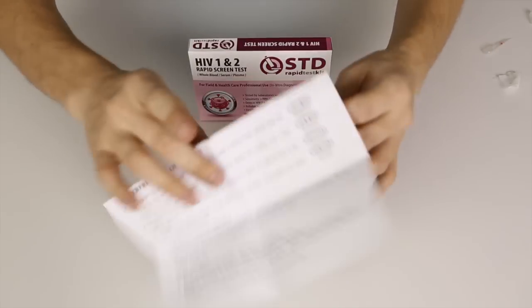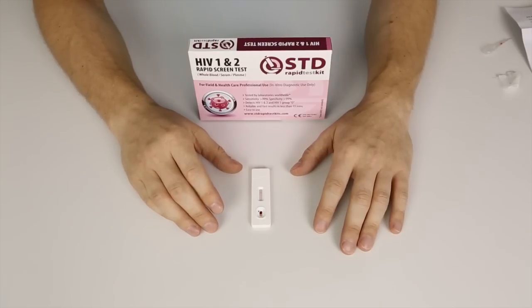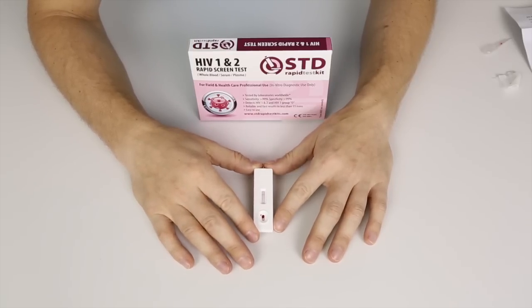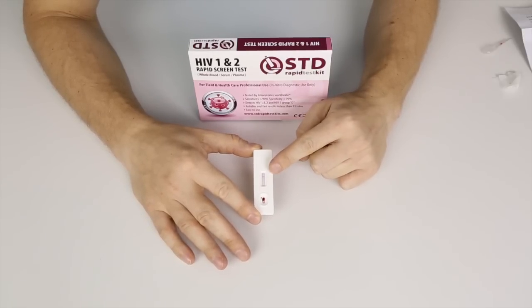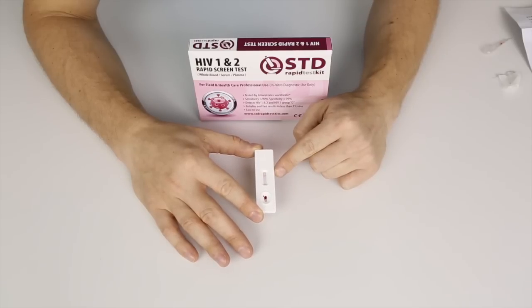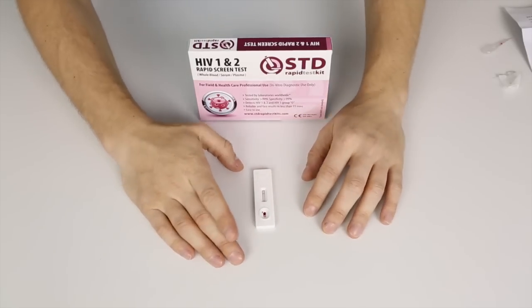We are going to have to wait a few minutes for the result to show. As long as you can see the single control line — there's a C here and a T on the other side — as long as you can see a control line next to the C, that means the test is working. We'll give it a little more time; just be patient.